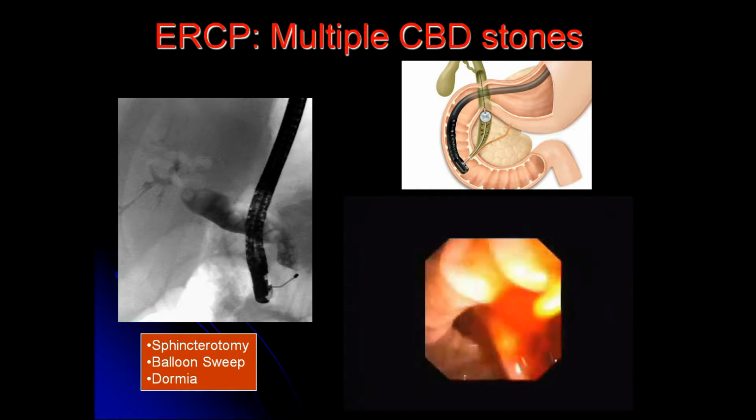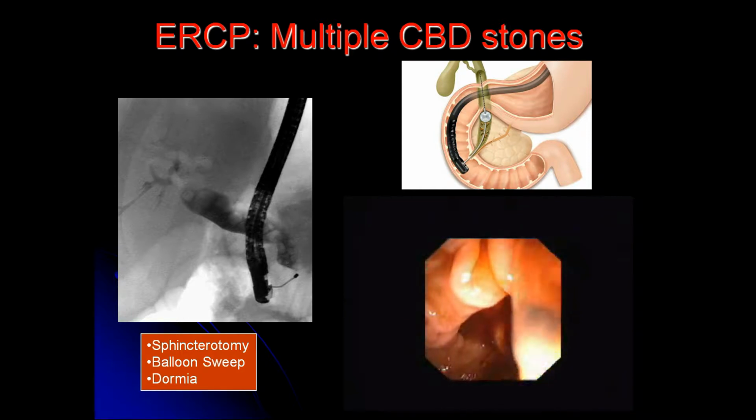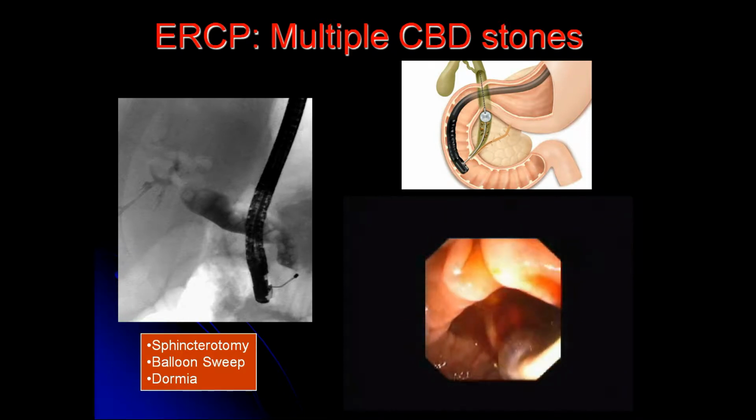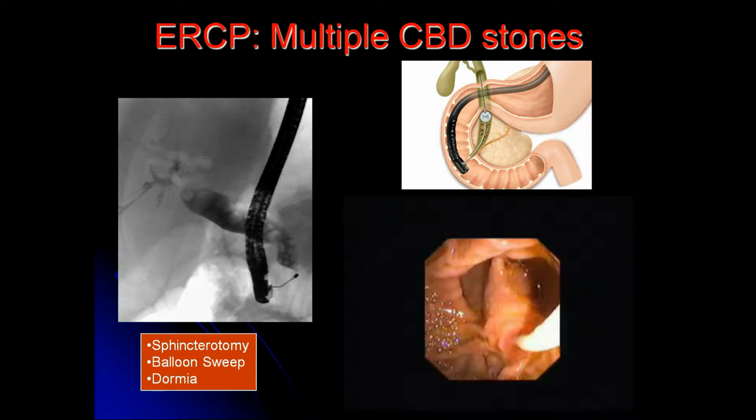We can go several times into the bile duct and inflate, and to ensure that all the stones are removed, the inflated balloon comes out in the inflated position very easily from above downwards.